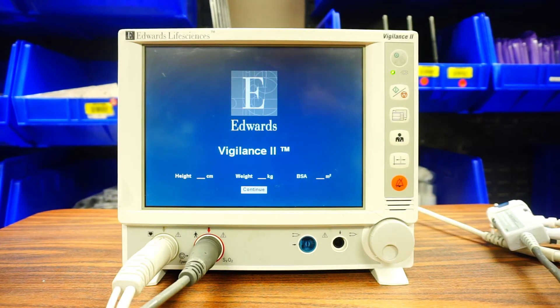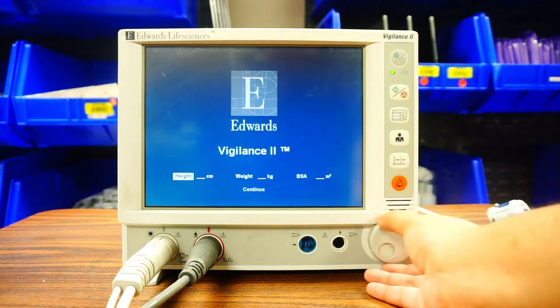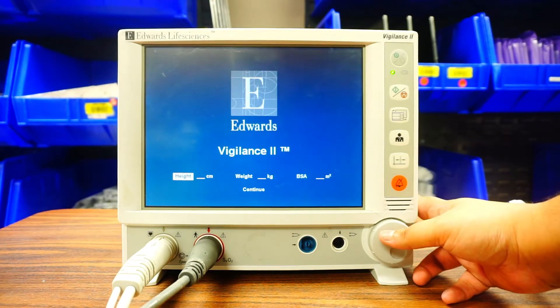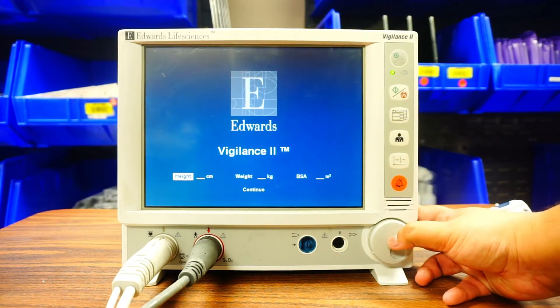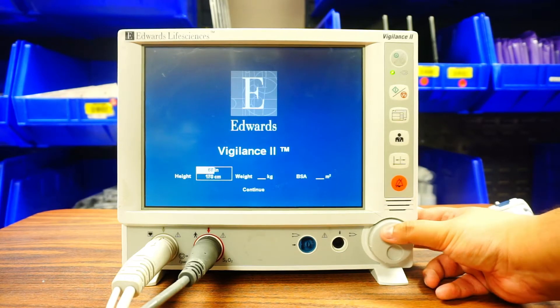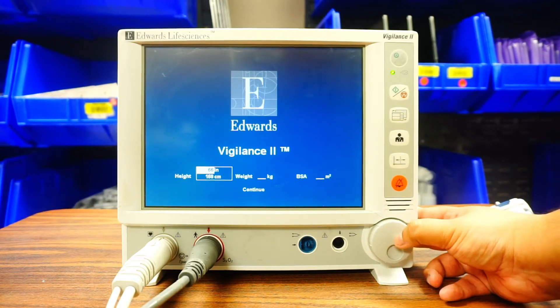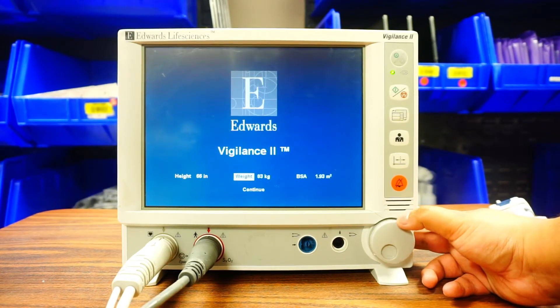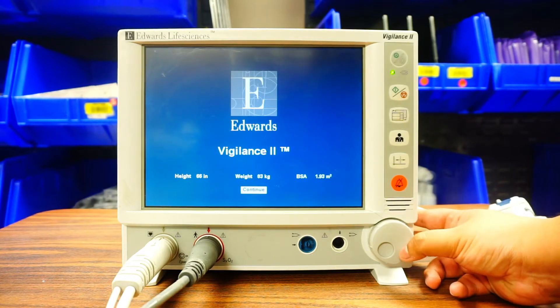Now with the Vigilance, I'm going to set the height and weight of the patient. I do not need to put in any other information for this monitor. You're going to use your toggle to go parameter to parameter. When you have it over height, click it — you can choose between inches and centimeters. I'll do inches and say the patient is 5'6". Then toggle over to weight and enter 83 kg. Body surface area will be calculated automatically.